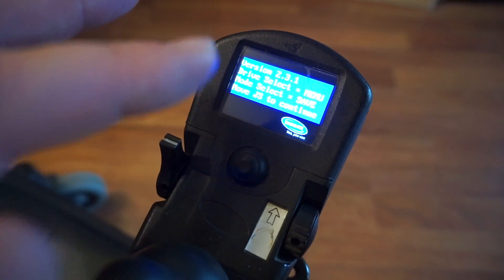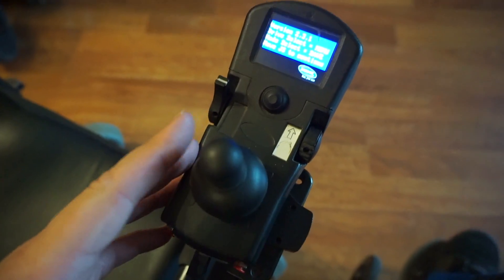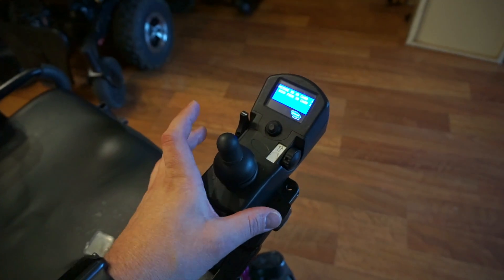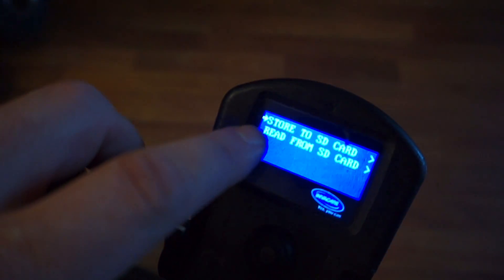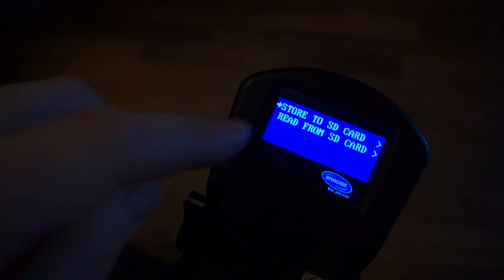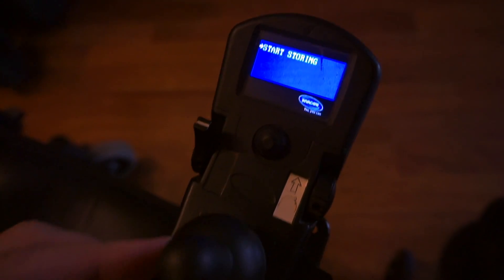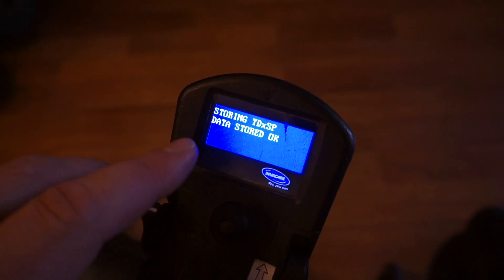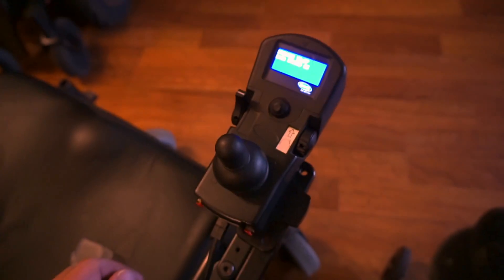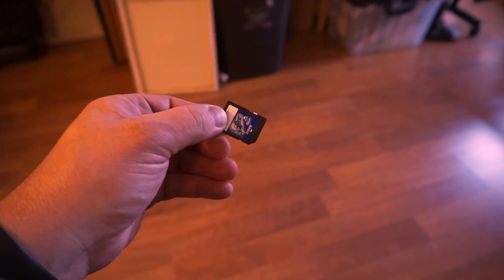Ignore that red screen — this chair actually has a glitch; you're probably not going to get that red screen when you turn it on. You're going to get this little screen here. What we want to do is push the joystick once to the left, and then we'll get this menu that says 'store to SD card' or 'read from SD card.' We need to copy the software off of this chair so we can put it in the computer and make our edits. So we're going to use the 'store to SD card' function. To move the arrow up and down, you push up and down on the joystick. Select 'store to SD card,' push left, then push left one more time to start storing. It'll take a few seconds and then it says 'data stored okay.' Turn off your chair, pull out your SD card, and now we can take it over to the computer.